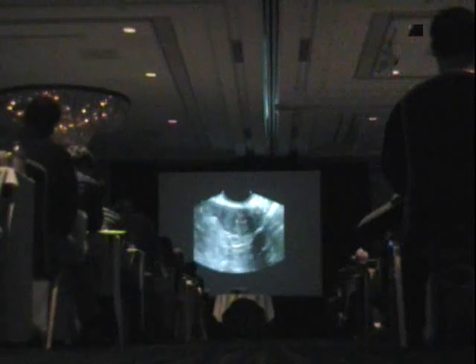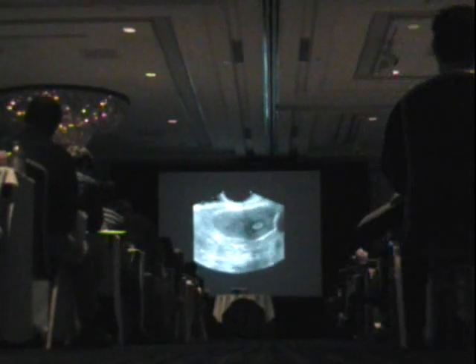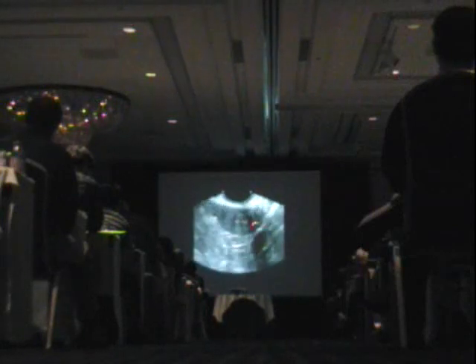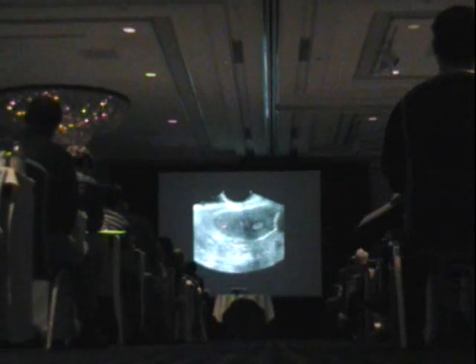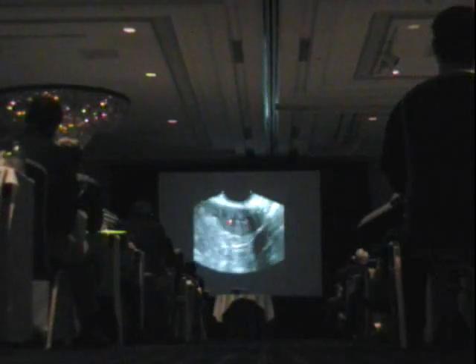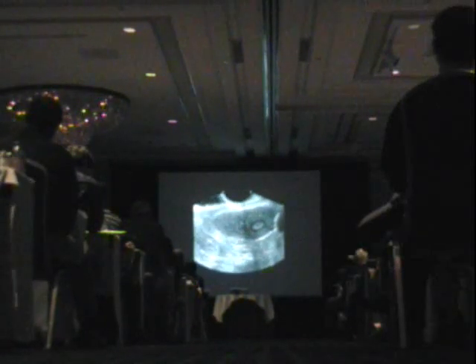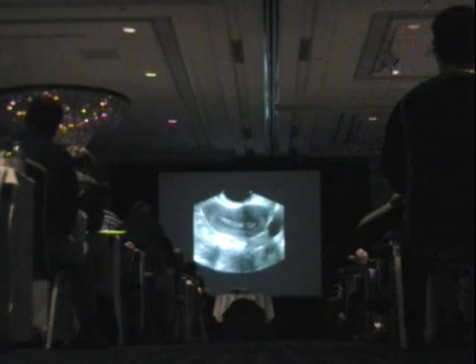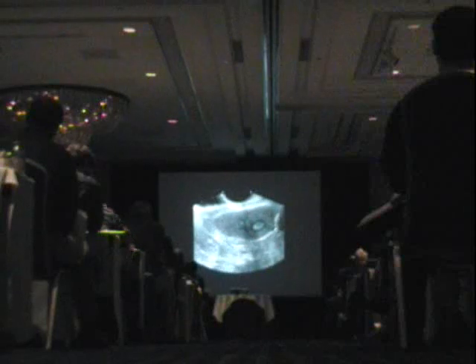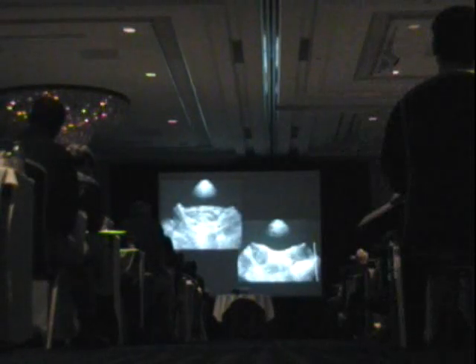Here's a clip of a patient where you notice that we start at the cervix and you can follow up two separate endometrial echoes, one that sort of stays straight and the other that bends off to the right, and this is a bicornuate uterus when these endometria move separately as they get up to the top. And 3D imaging has shown itself to be somewhat, some would say very useful, in looking at uterine anomalies.